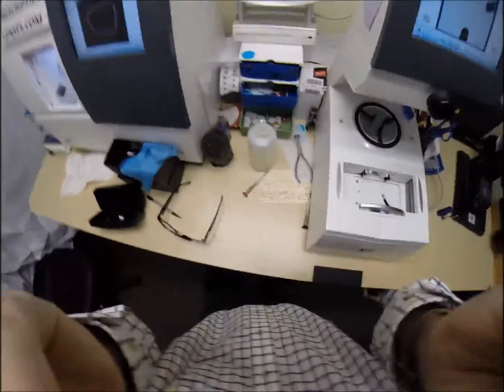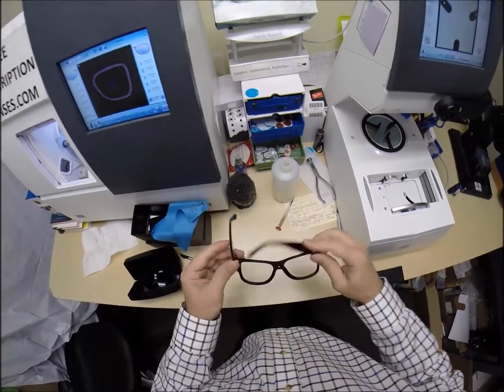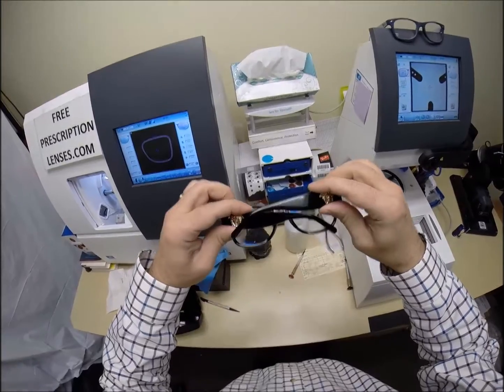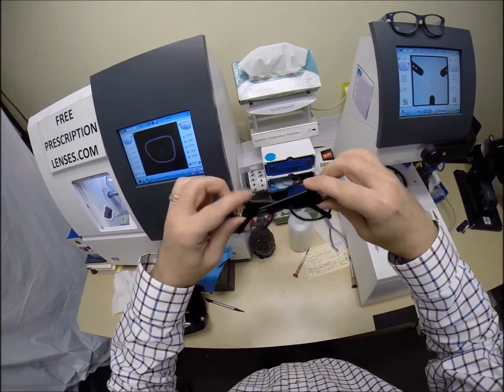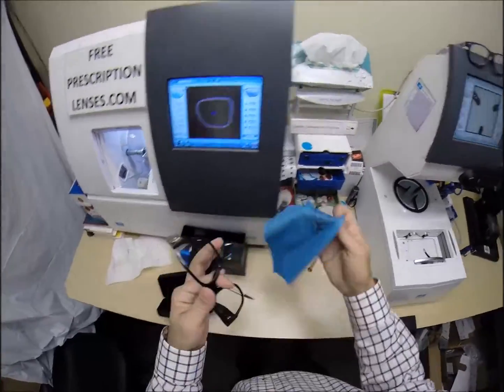Let me put mine back on so I can see what I'm doing. Flip these over, press down. There is no wobble. I close each temple to make sure they overlap perfectly. And they do, and neither one is askew like that. I want them overlapping, same amount of tension on each hinge. Now, this is what they look like clear.